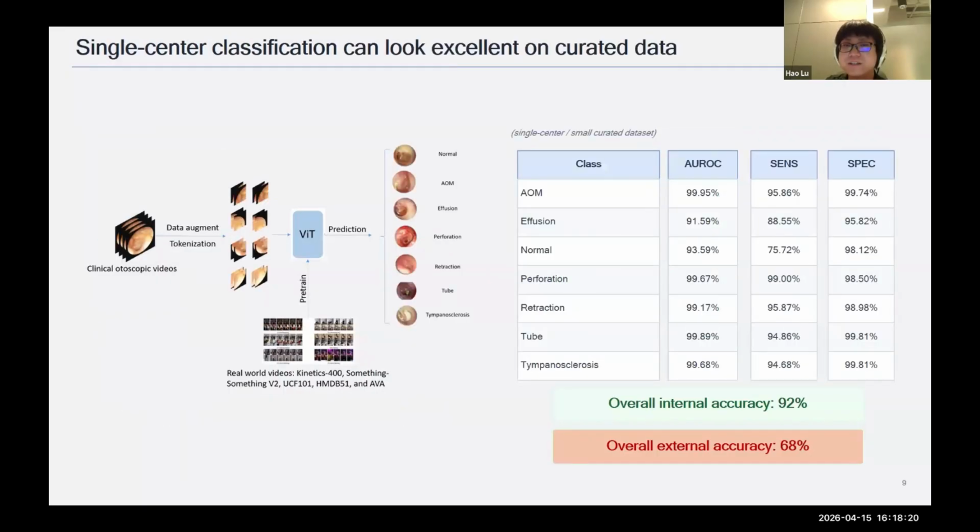And we didn't stop there. With the keyframe, we are trying to improve the classification model. As I mentioned previously, we only use a simple CNN model to do the classification. In this case, we are thinking, why don't we use a video model? Because CNN models still treat each frame independently. But if we use a video model, we treat all the frames together as a video, and we will use the temporal information.